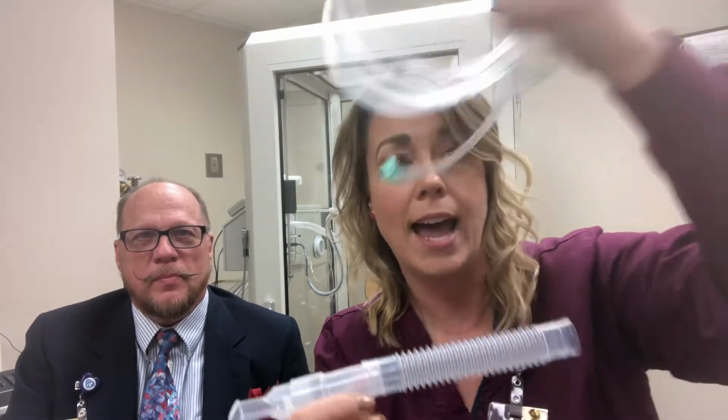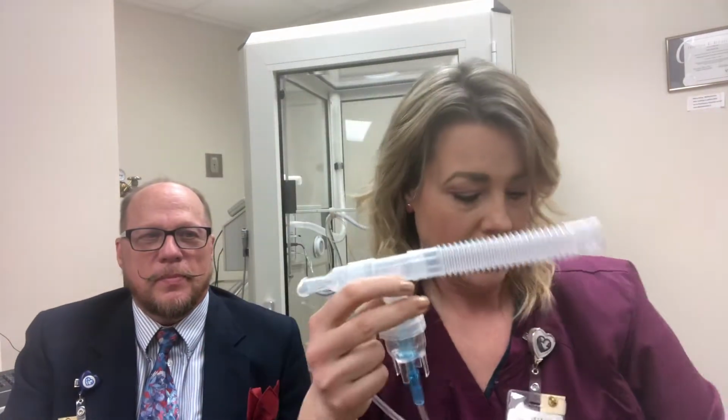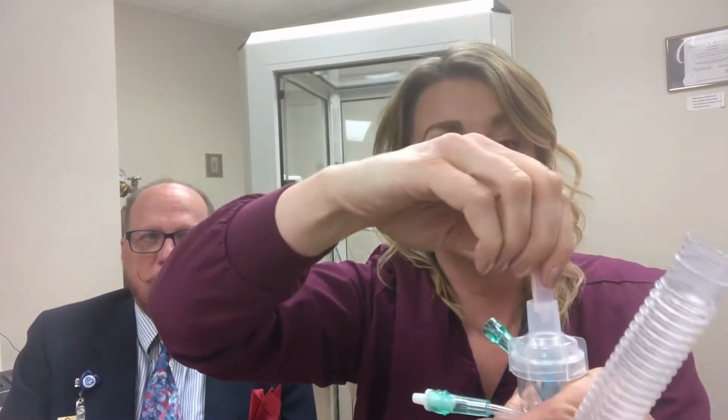And then you're going to get your tubing out as well. The blue piece we like to put on the end here, and then the other piece gets hooked to the flow meter, okay? We set our aerosols on the flow meter at about 8. Anywhere from 6 to 8 will work. So then we take this little T-piece off. You're going to open up your foil packet. You're going to take your squirt of medication, and you're going to just squirt it in.